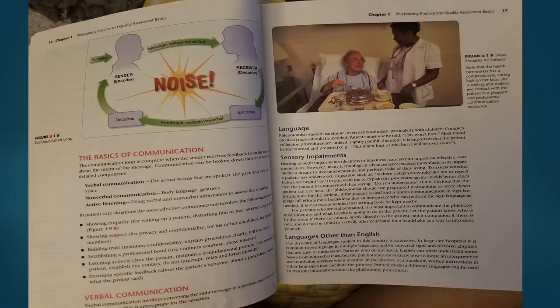If it is obvious that the patient did not hear, the phlebotomist should use pre-printed instructions or write down instructions for the patient. If the patient is deaf and requires communication in sign language, all efforts must be made to find an interpreter who can perform the sign language as needed. It is also recommended that writing tools be kept nearby.